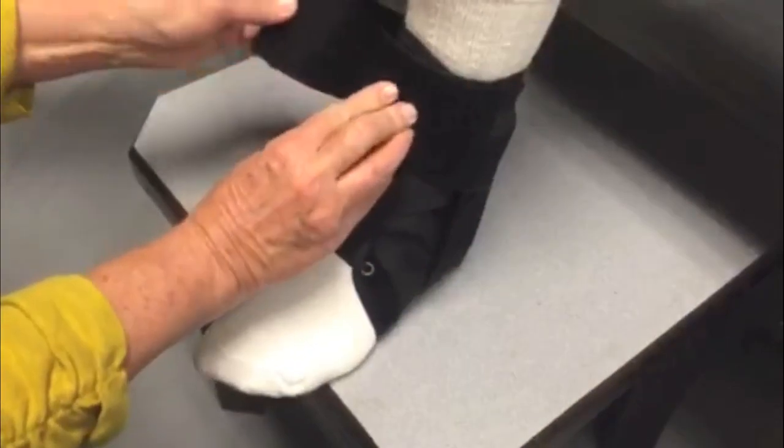Finally, when the brace feels comfortable and secure, wrap the elastic top strap over the laces and straps. Readjust if necessary.